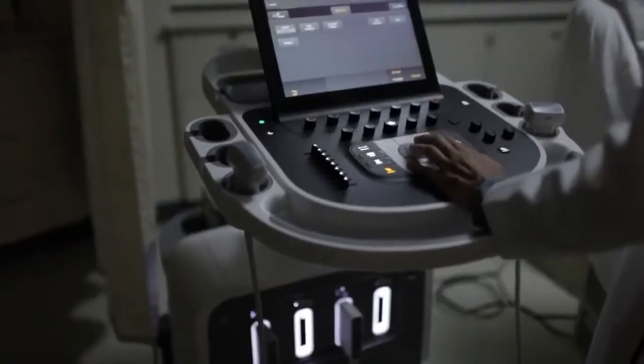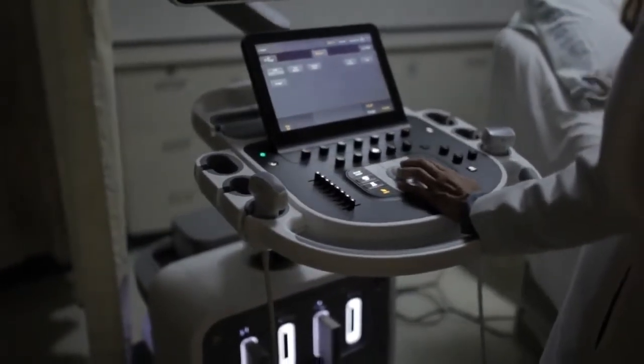And EPIQ is our greenest machine yet, consuming 25% less power than our traditional ultrasound machines.